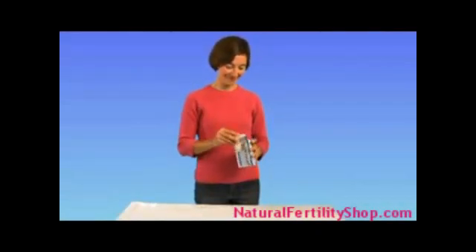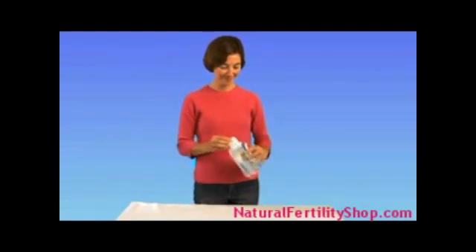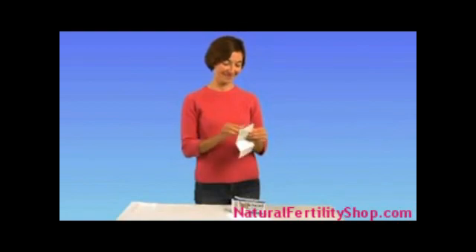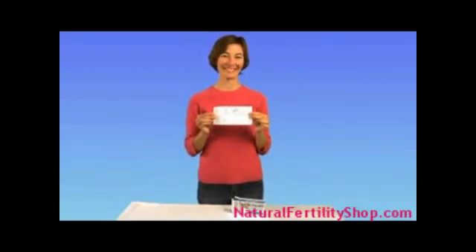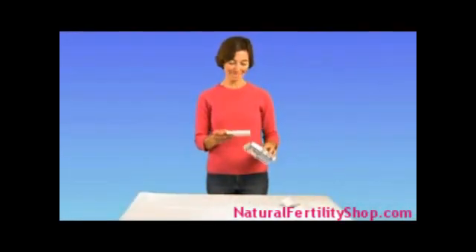The Fertile Focus is an easy-to-use saliva-based fertility test to help pinpoint ovulation and identify your peak fertile days. It comes with a complete set of instructions that clearly explains how to use the device and how to best interpret the results. Predicting ovulation is a simple process that will take only a few minutes.